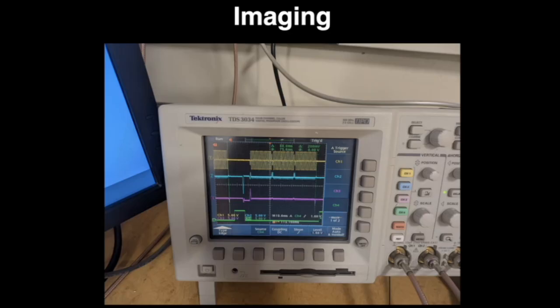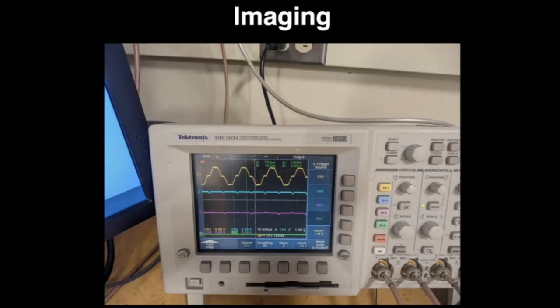So this is a real constraint in terms of what we're able to get out of the systems, at what resolution we're able to image and how quickly and how much coverage we can get. It turns out that those transitions between reading in one direction and reading in the opposite direction, you see how much time we spend here going from the negative to the positive direction.